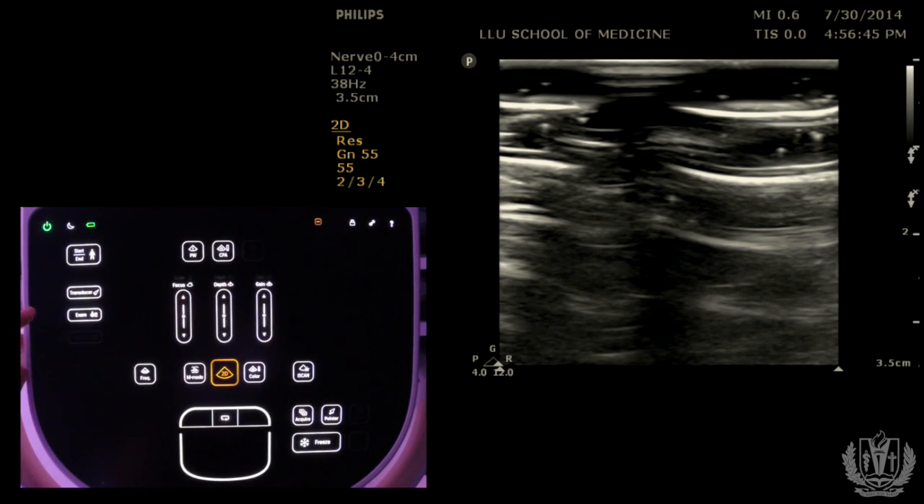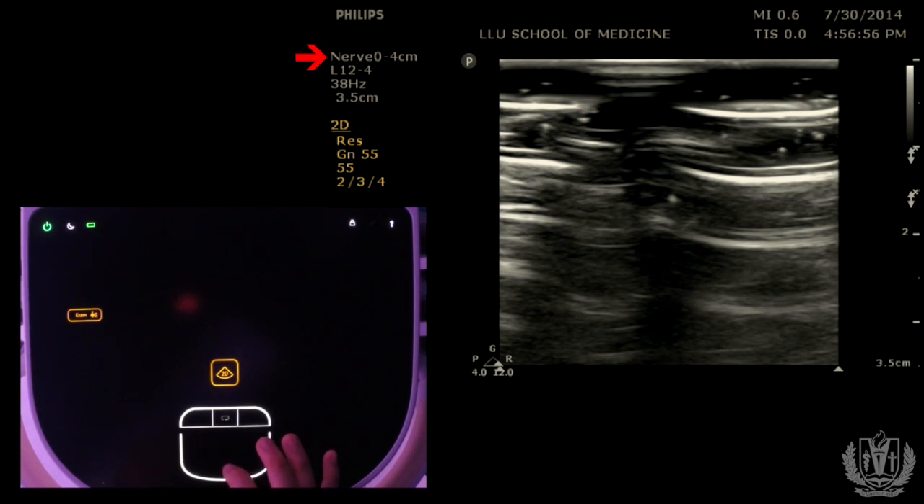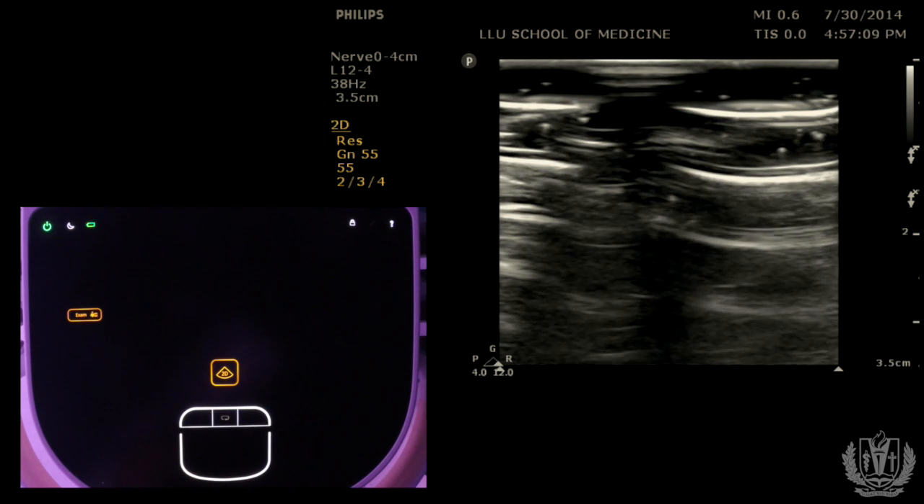After you pick the appropriate probe, you want to pick the appropriate application for the probe. Right underneath the transducer button it says EXAM. When you push EXAM, you see options on the top right of the screen. For the linear probe, you have musculoskeletal, ocular, arterial, venous, vascular, lung, or nerve applications. Select the correct preset because that will optimize your frequency and penetration for that application.